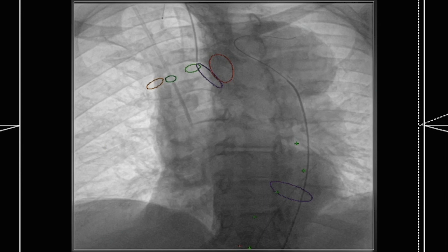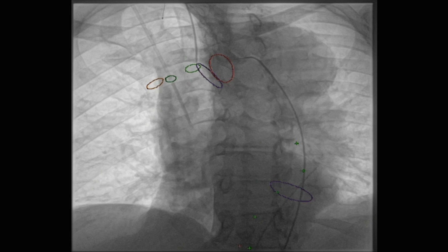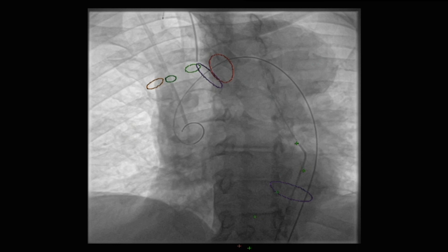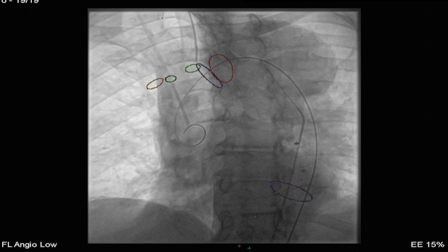The most distal of the purple marks represents the distal landing zone for the stent graft. The wire was curling up inside the aneurysm itself — it's now been replaced with the curved Lunderquist wire. Over the curved Lunderquist wire, the pigtail catheter will actually be brought up in parallel. This will be used to, number one, validate the fusion which has taken place, and secondly, to guide the stent graft placement.